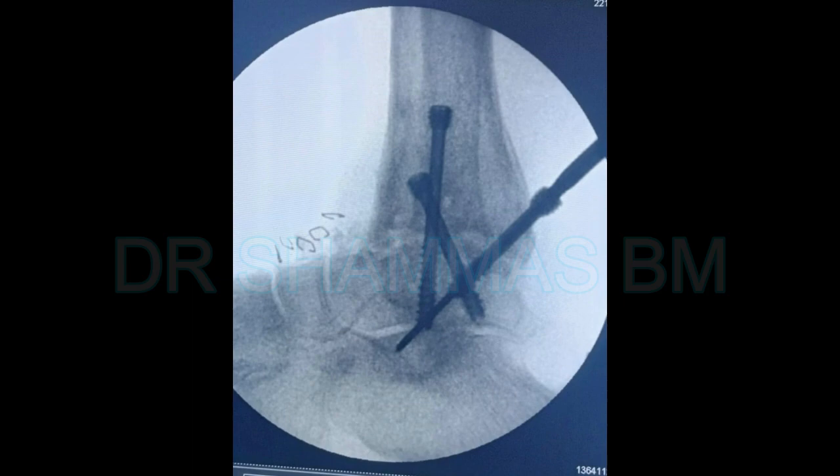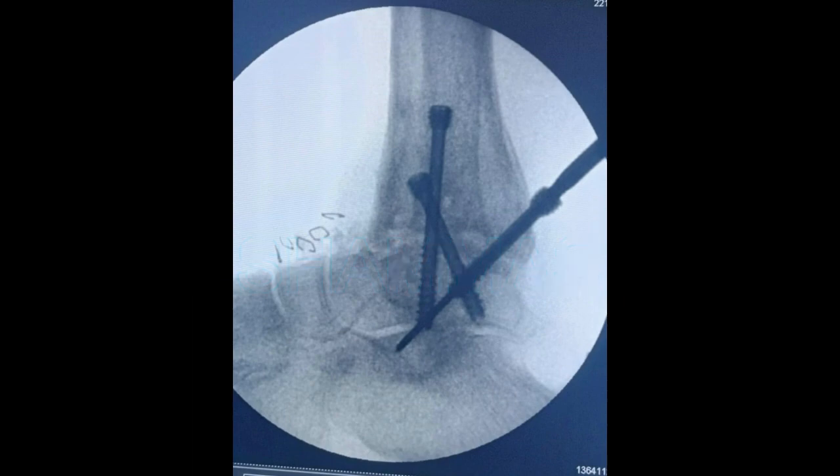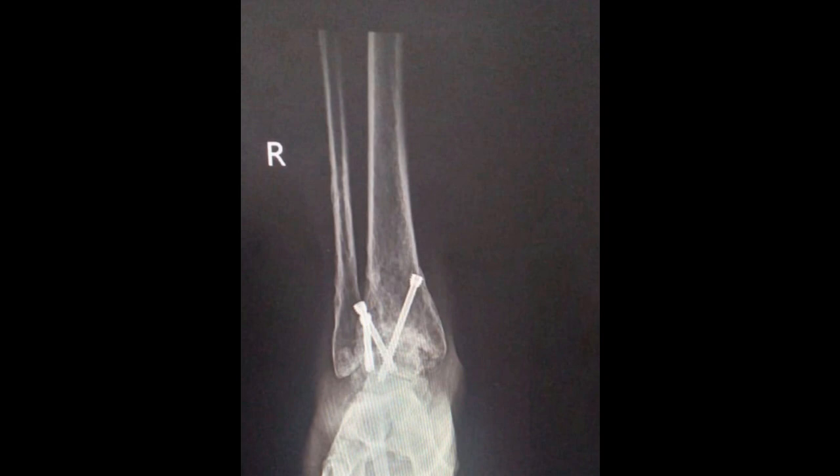These are the compression FT screws from Arthrex. The screws are being put — you can either put two screws or three screws according to the scenario. Here I have put three screws. This is the C-arm image, and this is the postoperative image — AP and lateral views. Since the patient had more bone stock on the lateral side, I used the screws more on the lateral side than the medial side. And this is the final X-ray after three months.